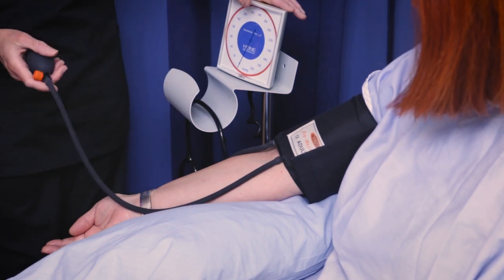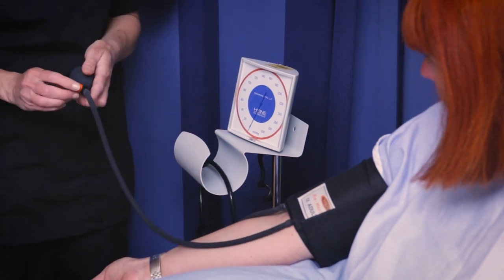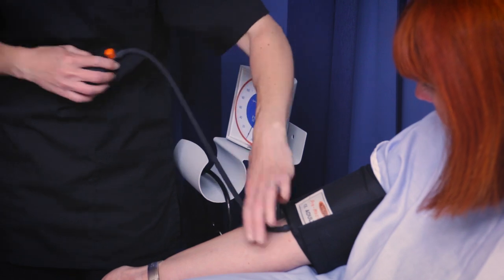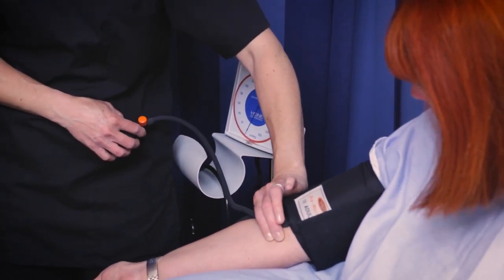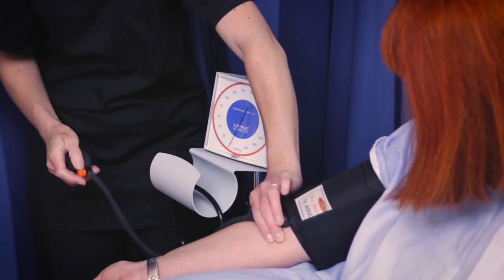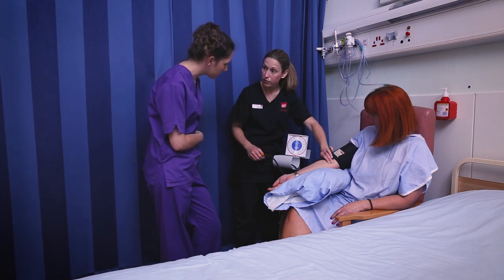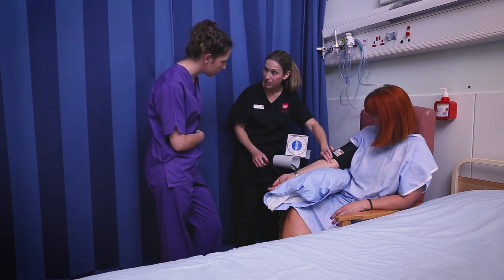So we've got our sphygmomanometer here, and we also need a stethoscope for this. The first step is we need to close off the valve. What I'm going to do is palpate the brachial artery like we did before, and then pump up the cuff until I can no longer feel the pulse.